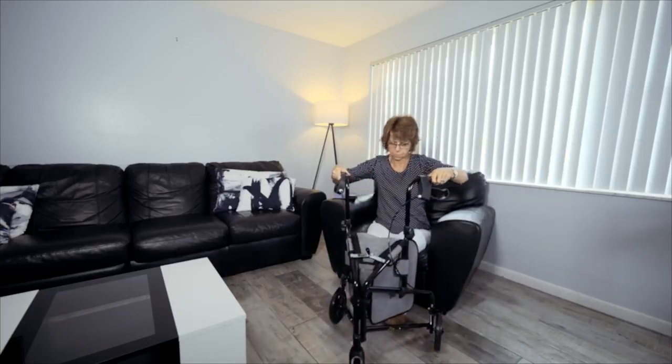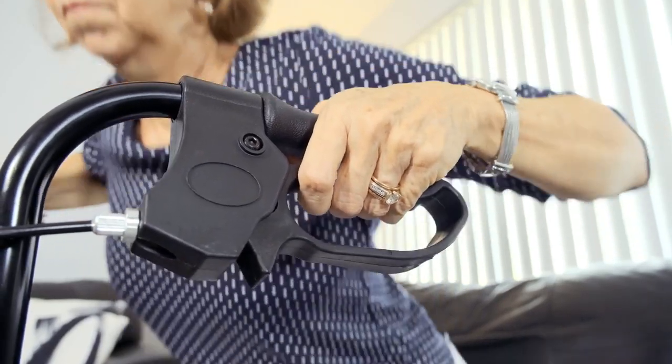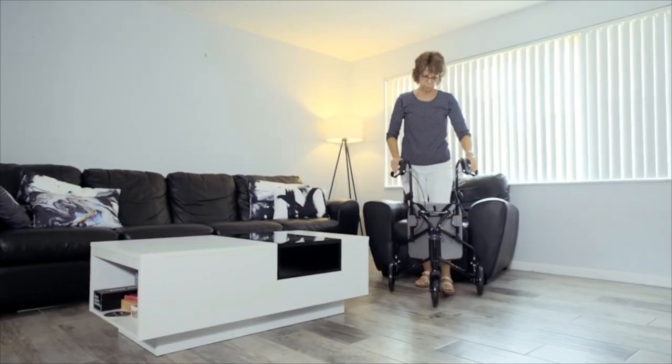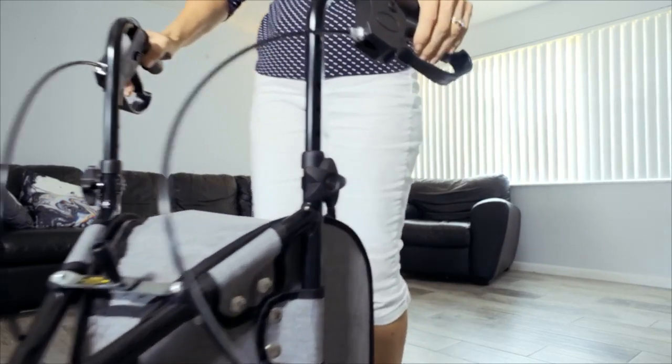And when you do, the Rollator doubles as a stand assist with stabilizing support from the ergonomic hand brakes that can lock the wheels in place. This is perfect for extra stability and security when you need it most.